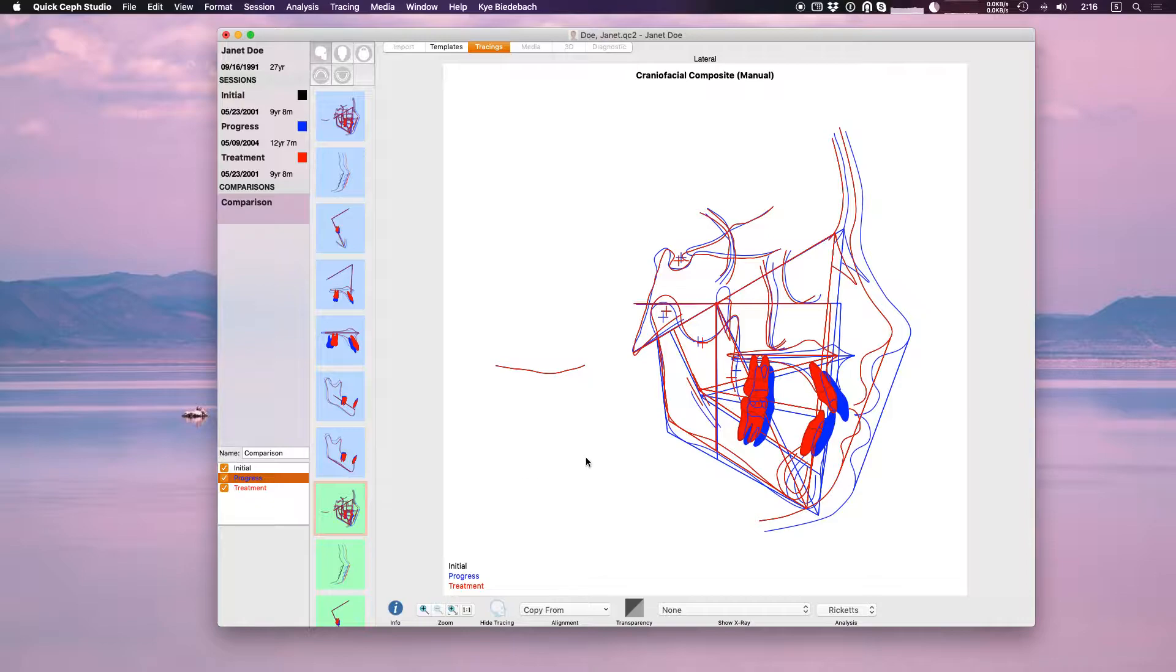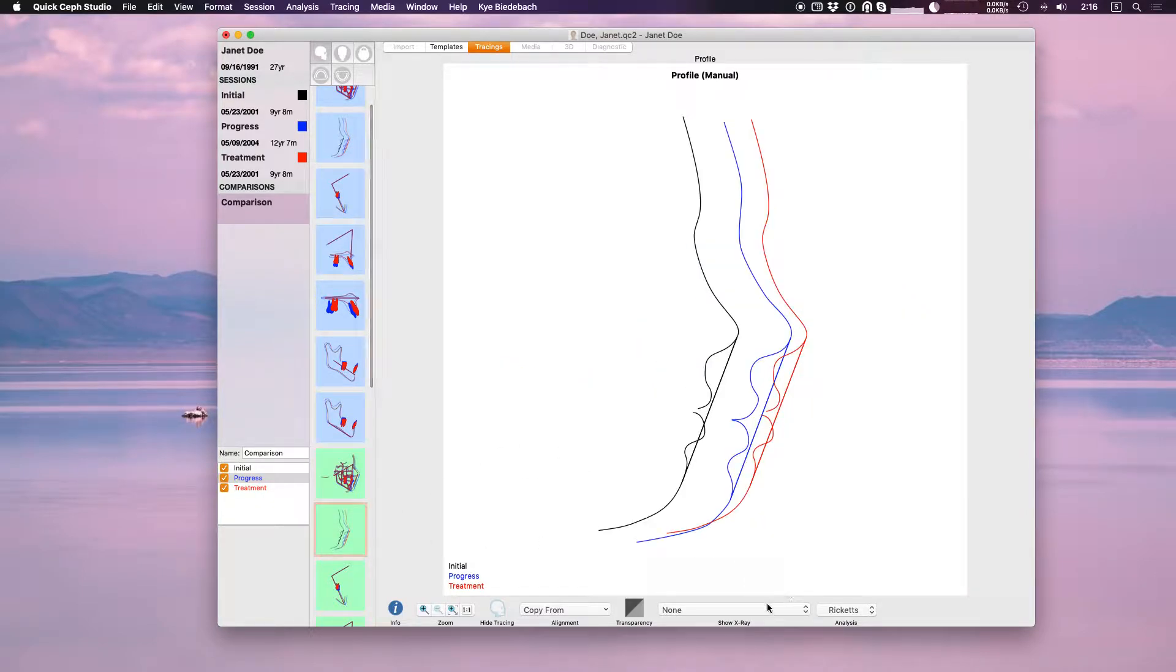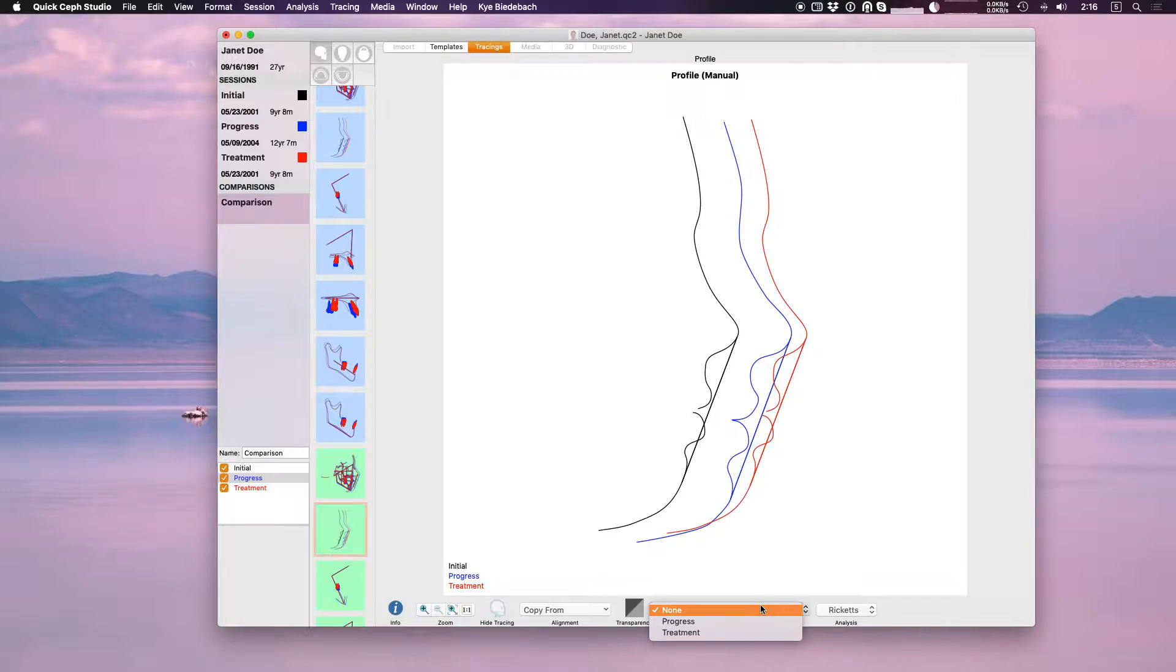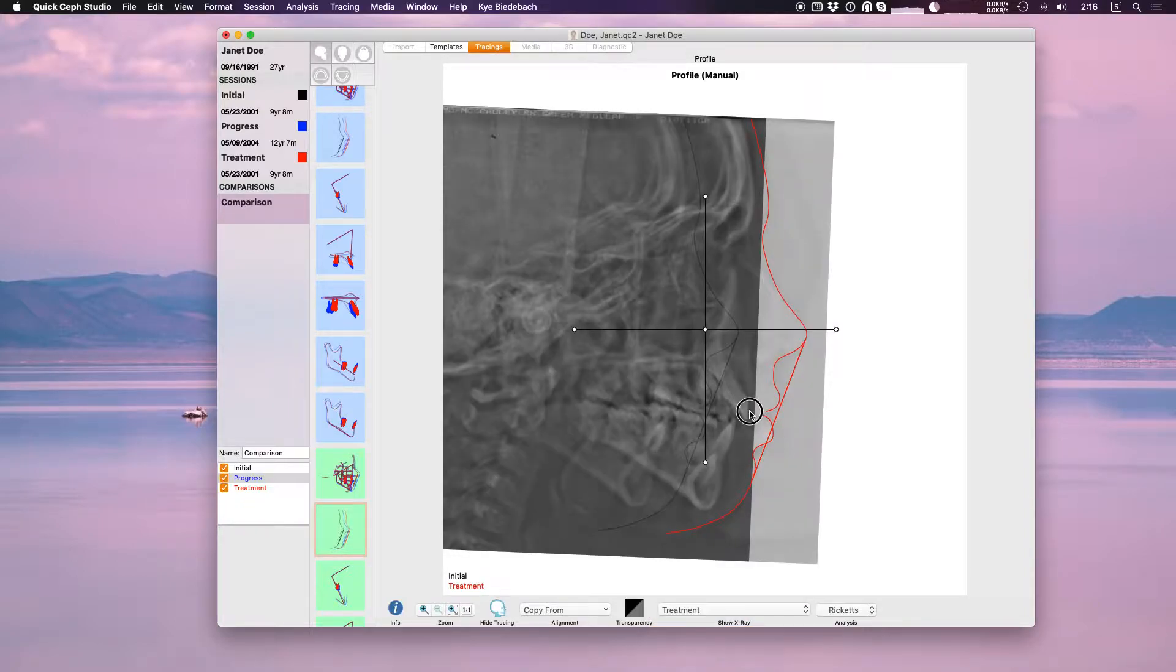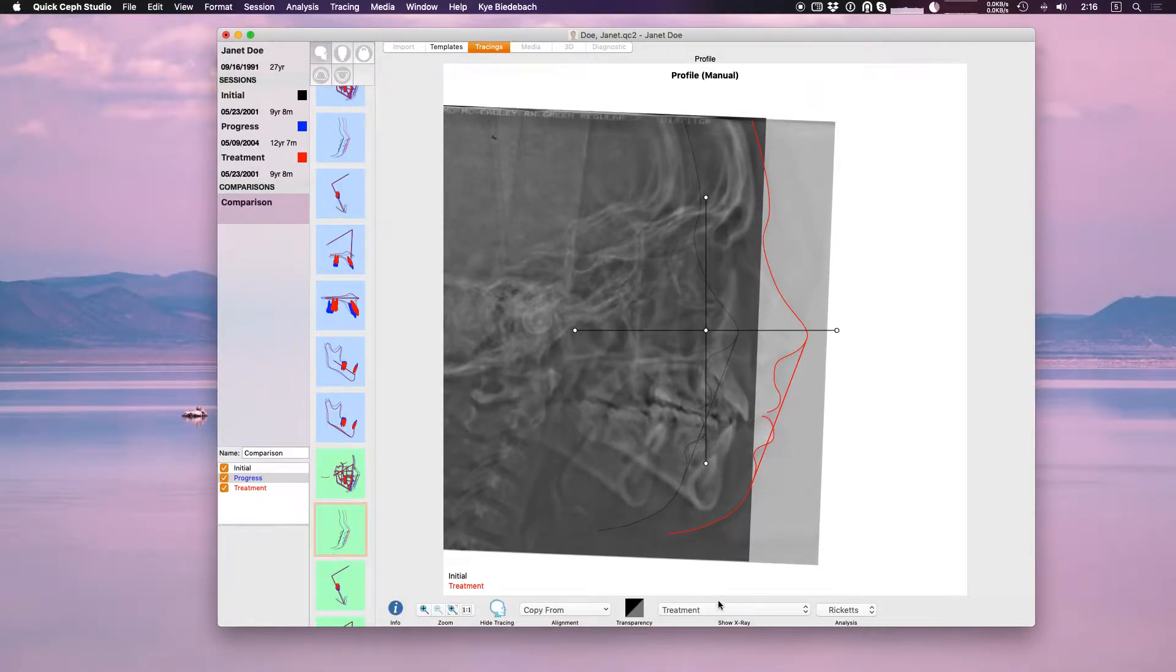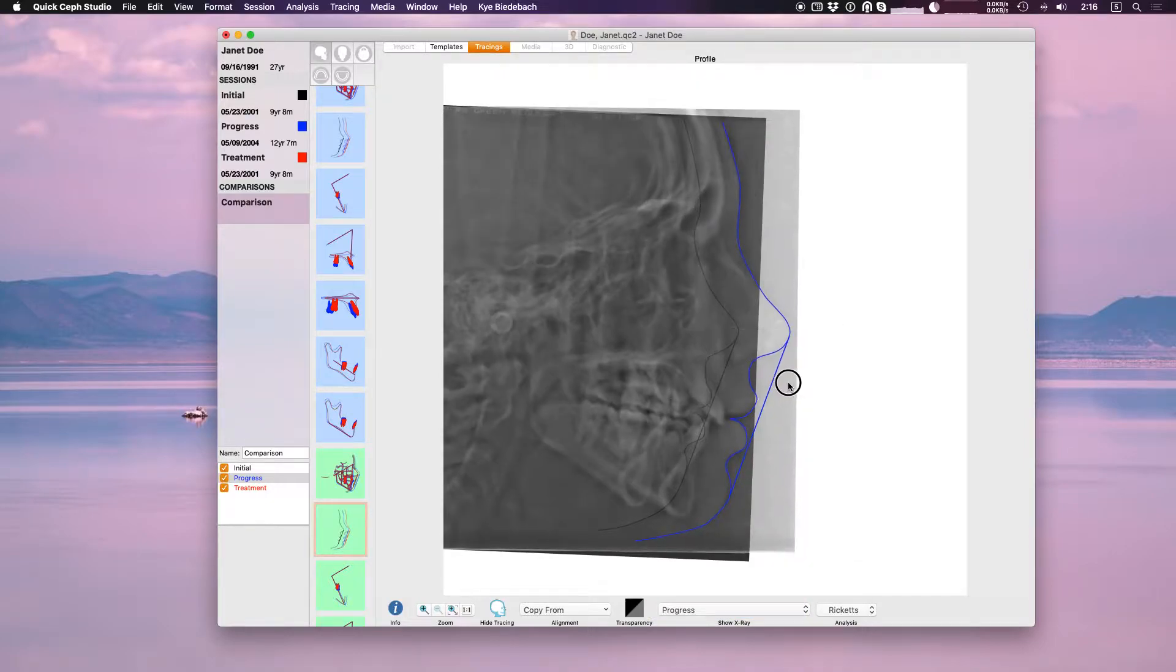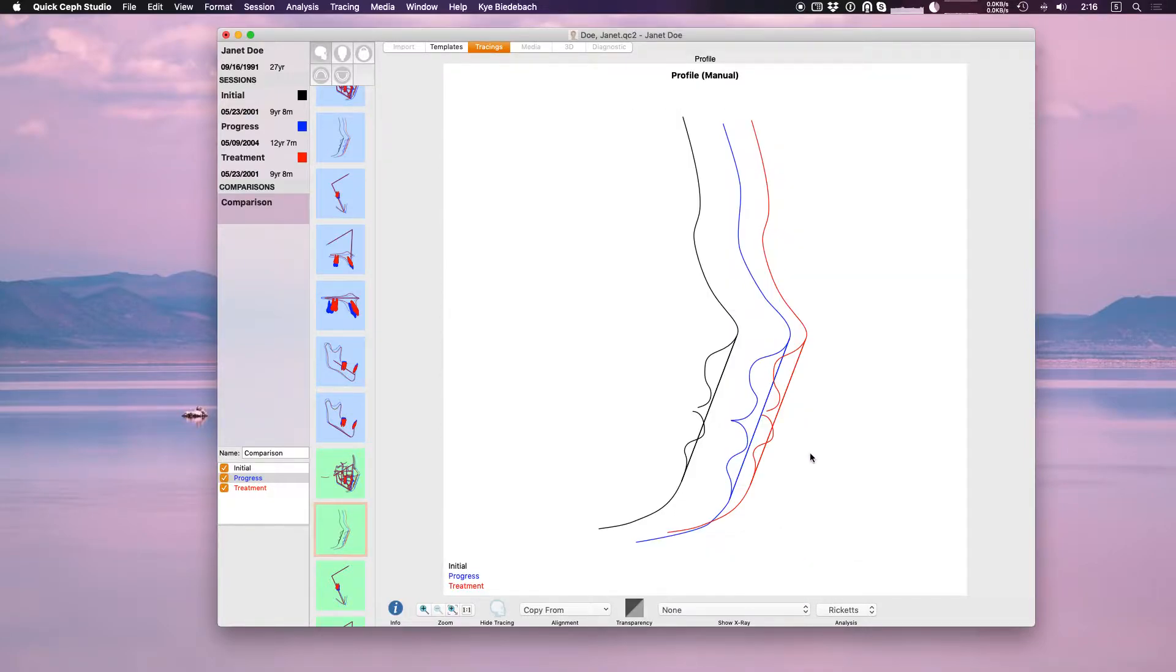But if I do have all three going and I go back to a manual one here, I can choose which x-ray. Now remember initial's the top one, it's always going to be the bottom most x-ray. Now what do I want to place over that initial x-ray? I could place just the progress x-ray over initial. And that is how to do manual superimpositions with QuickSaf Studio.